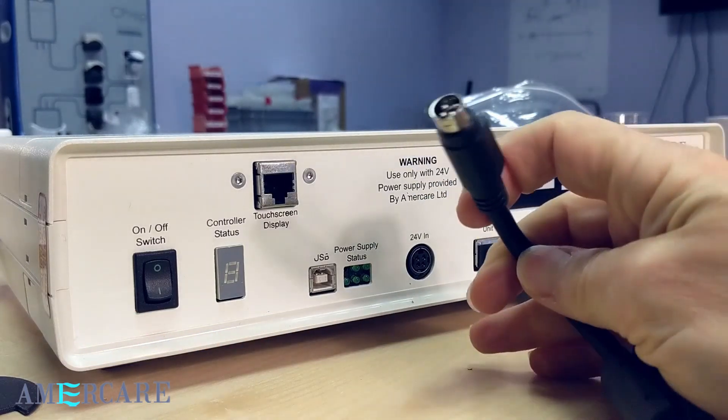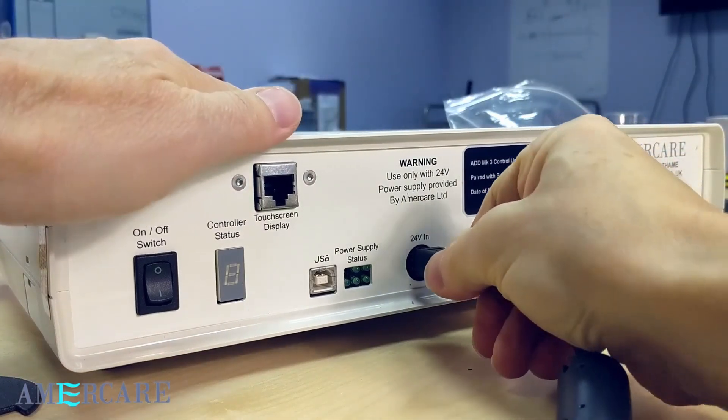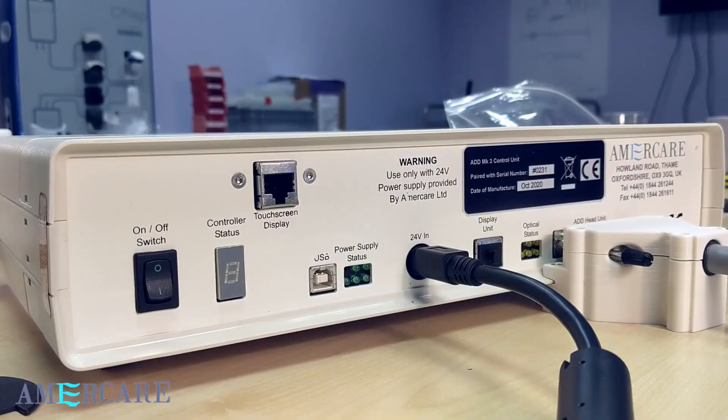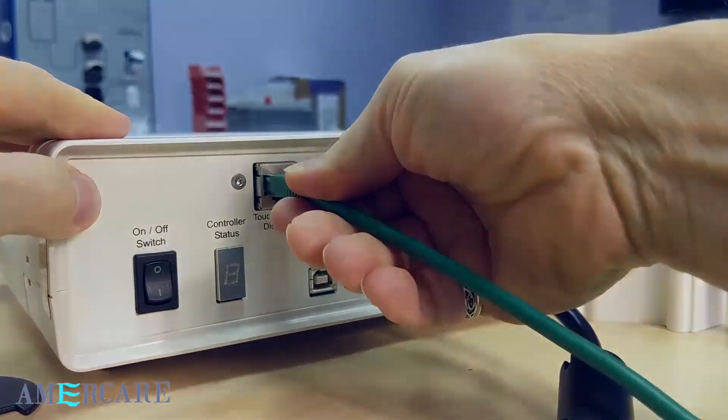The unit is powered using the supplied 24 volt power brick. The plug end simply plugs into the socket on the control unit labeled 24 volts in. The display's CAT5 cable plugs into the socket labeled touch screen display.